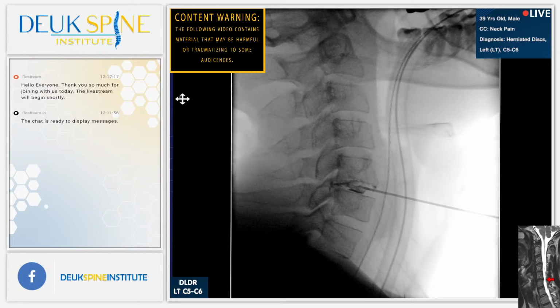There's your tear right there. Beautiful. Get that. Hey, let's put this on the website. This is another website picture. Keep your arrow right there. Henry, take a picture right here. This is beautiful. Huge tear. And now, Jordan, put your arrow on the disc herniation. So you can see the tear and you can see the herniation right there. See the little bubble? Henry, did you get that? Yes, we did.